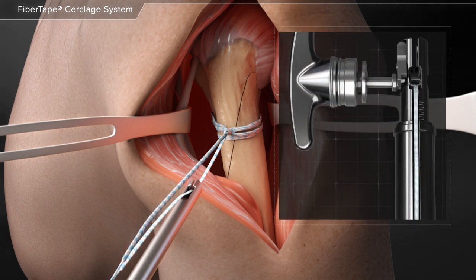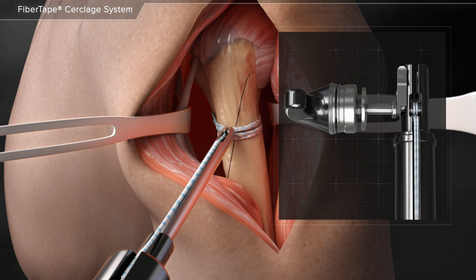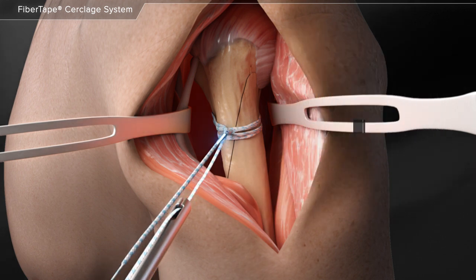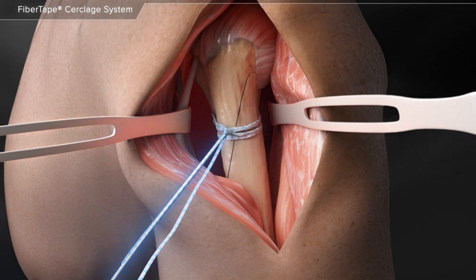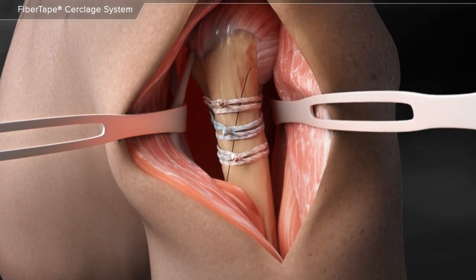Again, the suture is loaded into the tensioner and the half hitch is tensioned to the desired tension to lock down the repair. Two alternating half hitches are then added by hand and the suture tails are cut, completing the cerclage suture placement. Additional cerclage sutures can be added depending on the size of the fracture.